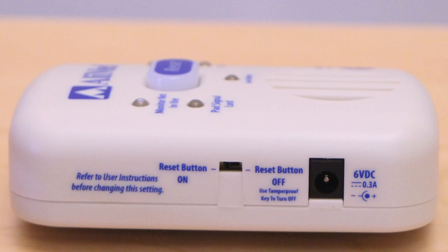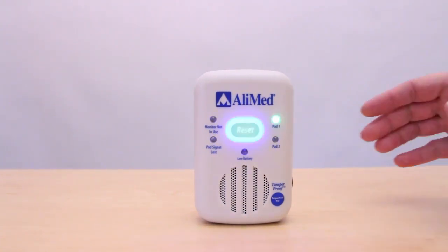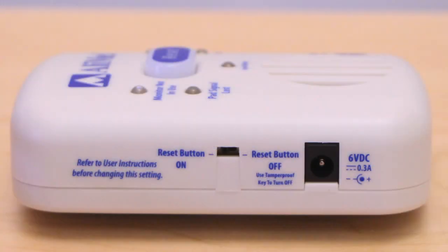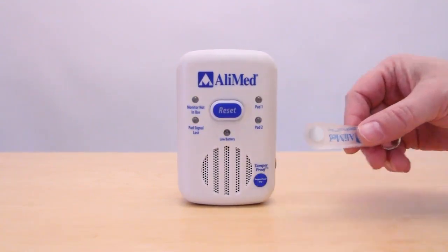Before using with a patient, check the reset settings. If the reset button has been set to the on position, anyone can simply press the reset button on the front of the monitor to turn off the alarm. If the reset switch is set to off, the reset option will be disabled and the alarm will continue to sound, and can only be silenced with a unique tamper-proof key included with the system, which prevents anyone except a caregiver with a key from turning off the alarm.